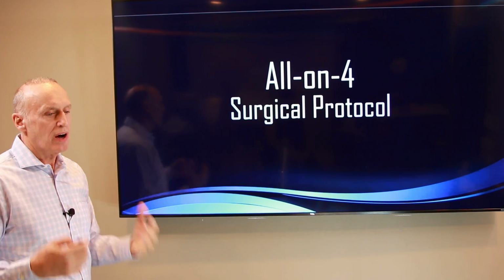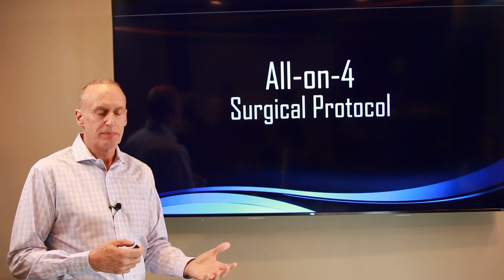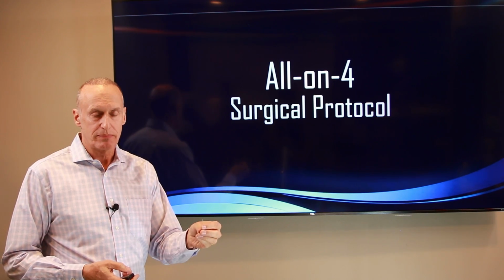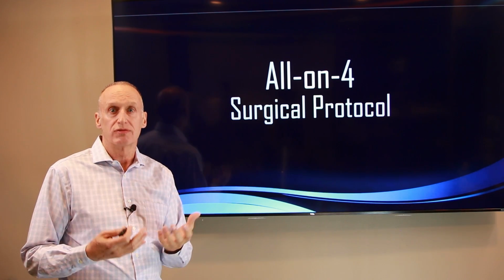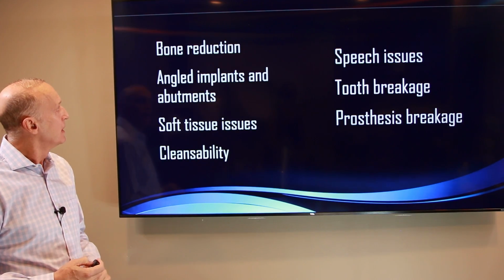So let's talk about that All-On-4 protocol of bone removal called alveoplasty. And in one of my other videos, you'll see that I actually call it alveolectomy. Alveoplasty is the smoothing of bone. Alveolectomy is the complete removal of chunks of bone. And that's really what this procedure does.